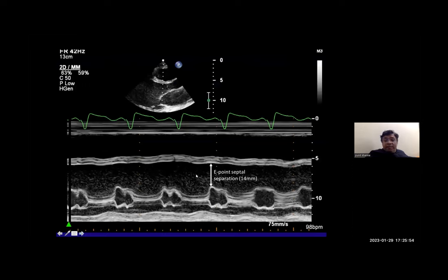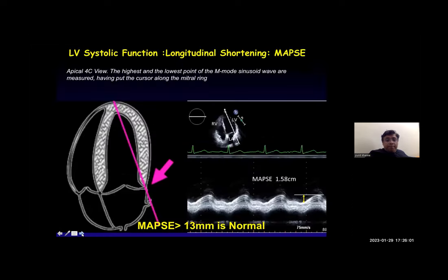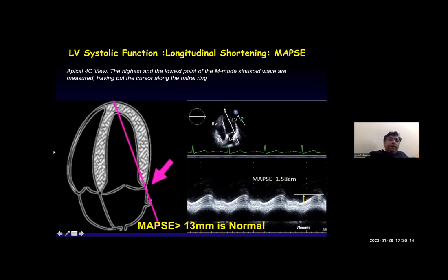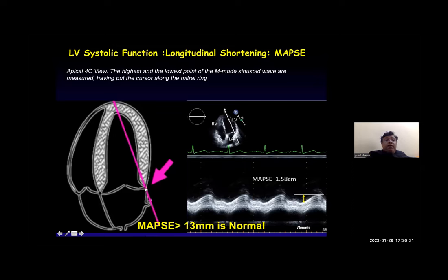MAPSE (mitral annular plane systolic excursion) tells us about LV systolic function — it represents longitudinal shortening. In an apical four-chamber view, the cursor is placed along the mitral ring and the highest and lowest points of the M-mode sinusoid wave are measured. A MAPSE of greater than 13 millimeters is considered normal.